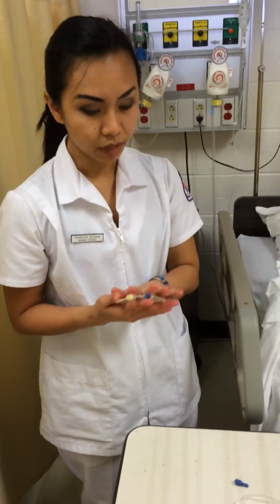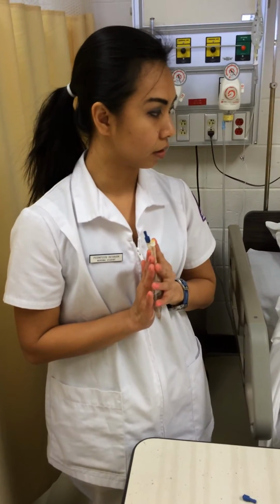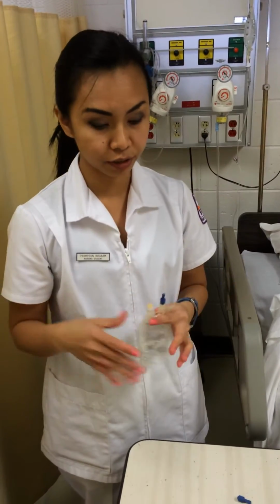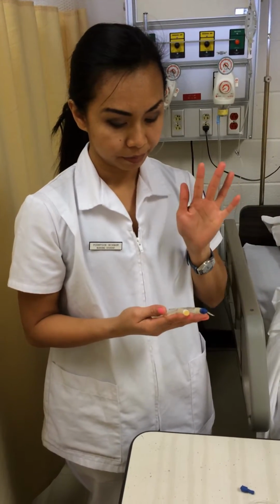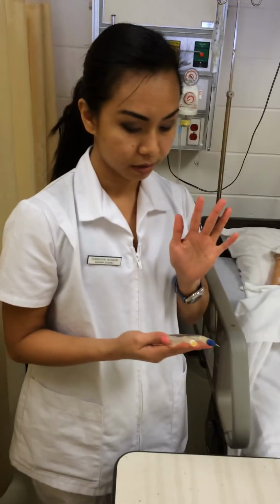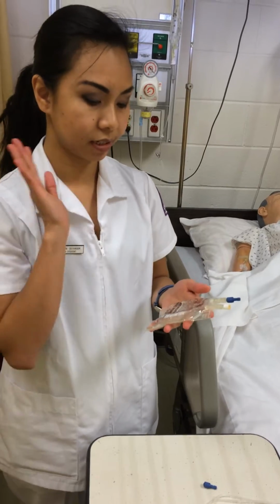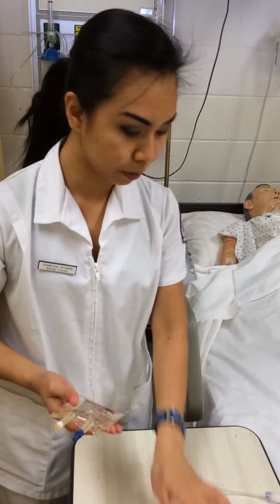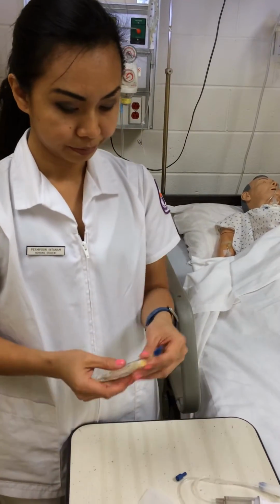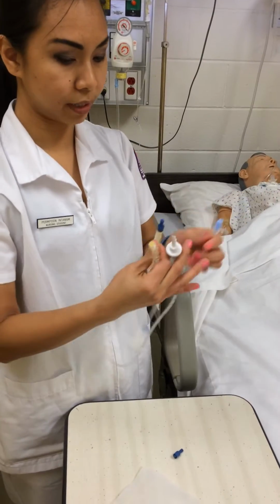So I check the medicine with the patient's chart and the patient order, compare, and I check the label 3 times, compare 3 times. And then I timestamp my name, the medication, and the date and time. After I put on the label, I prepare my tubing.